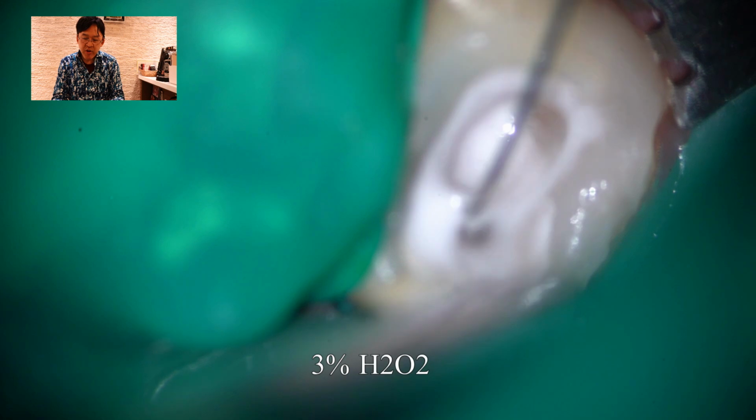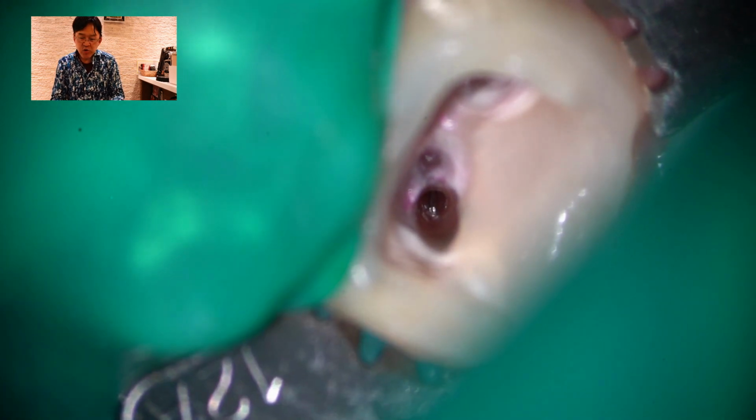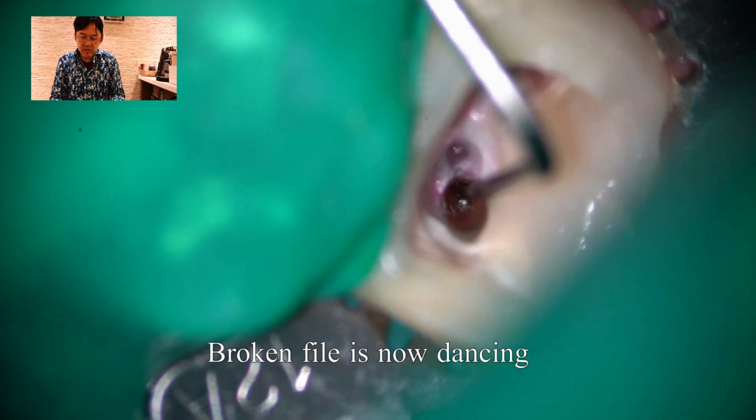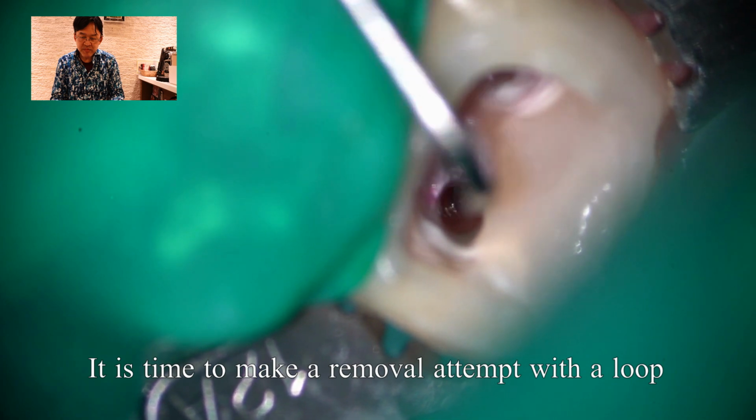I use sodium hypochlorite to remove oil. Then I use 3% hydrogen peroxide to neutralize the solution. Now you see the instrument is dancing. It's loose.